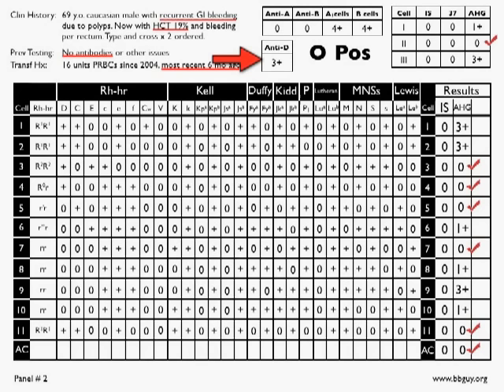And then we move on and look at the antibody screen, and you see we have reactions at AHG only in cell 1 and cell 3. Okay, let's look at the panel itself. Again, let's glean what we can glean from this situation. And I've deliberately thrown something at you here that you really shouldn't see.